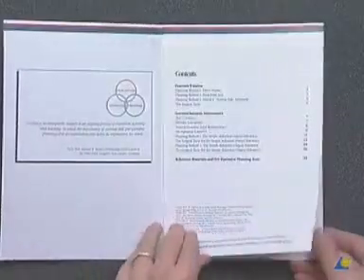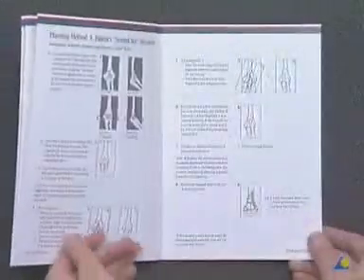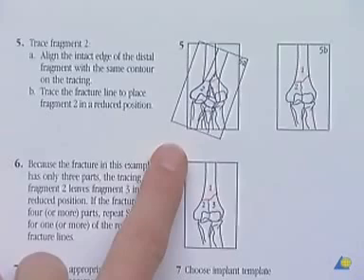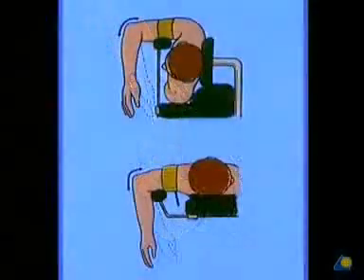This facilitates pre-operative planning, which should always be done in such a complex fracture situation. For the final fixation, the plates should be placed at right angles to each other. The reconstruction plate lies on the dorso-radial side of the humerus. The 1/3 tubular plate acts as a buttress on the ulnar crest of the bone.